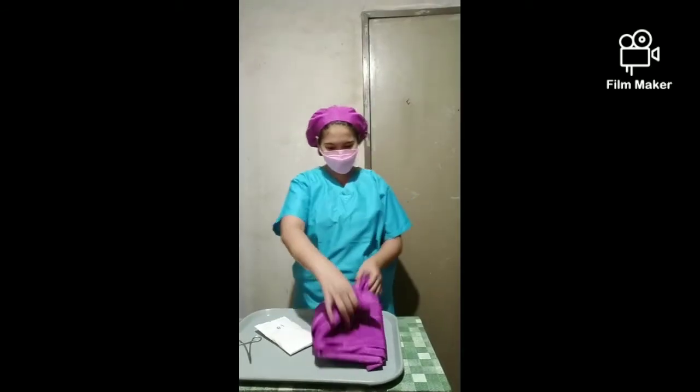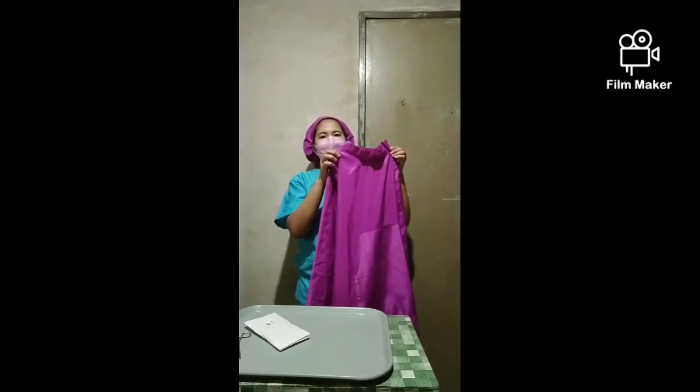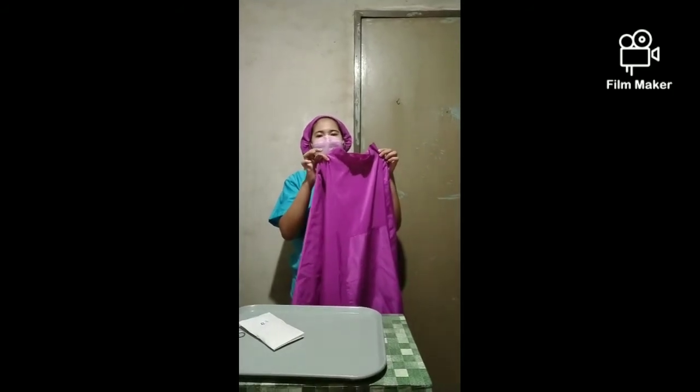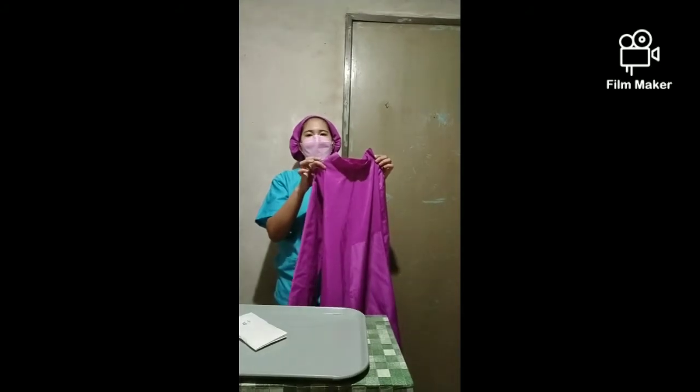Facing the sterile field, hold the gown by the inside tip of the neckline and allow it to unfold. Make sure you have not touched the outside of the gown because it reduces the sterility of the gown. Position the gown so that you are facing the wrong side of the front part of the gown to avoid confusion in wearing it.